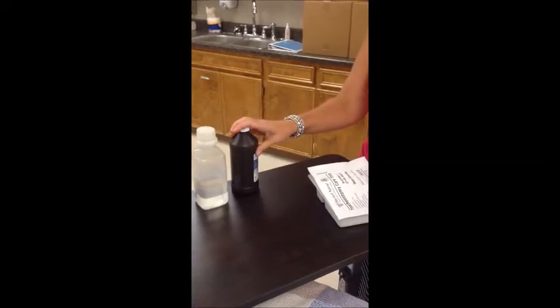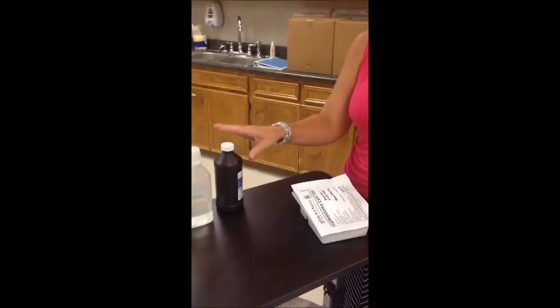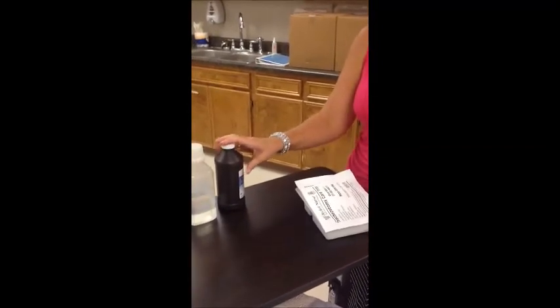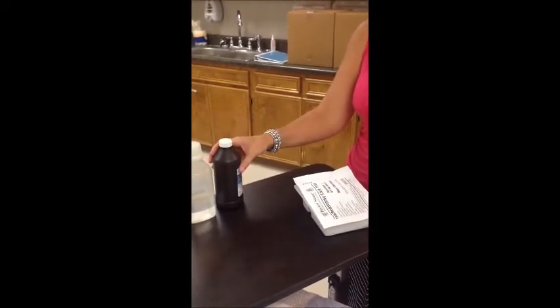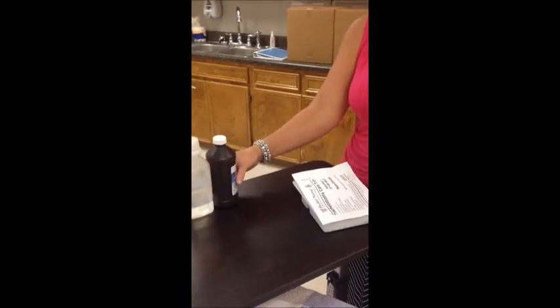The thing that they want to be careful with is if you put peroxide on the patient's skin, be sure to wipe that off with saline before you just leave it on there, because it can break down the skin if it's left for a really long time.